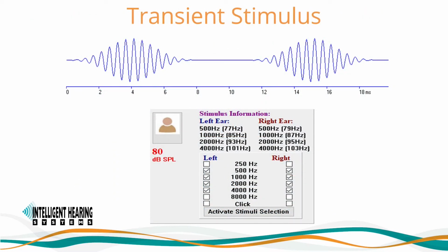The repetition of transient stimulus, as used to generate ABRs, can also be used to generate ASSRs. It is believed that the short onset durations of transient signals produce greater synchrony of neural discharges. Therefore, they in turn should produce stronger, more robust responses as compared to the longer onset or rise-fall times of amplitude-modulated stimuli. This is the reason why IHS turned to transient types as the default stimulus for the SmartEP-ASSR software. Transient types of stimuli include clicks, short-duration pure tones, frequency-centered tone chirps, or I chirps, and band-limited noise signals.